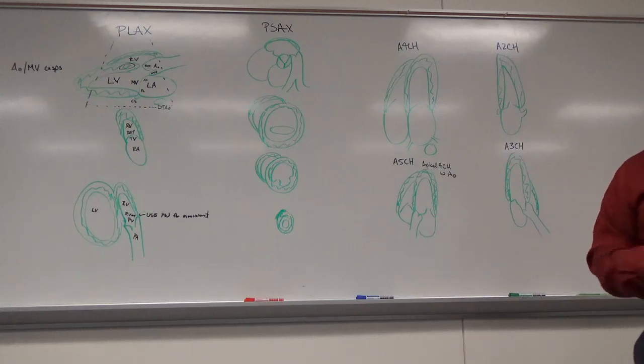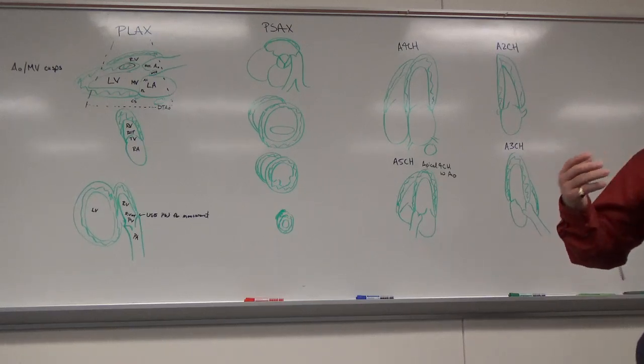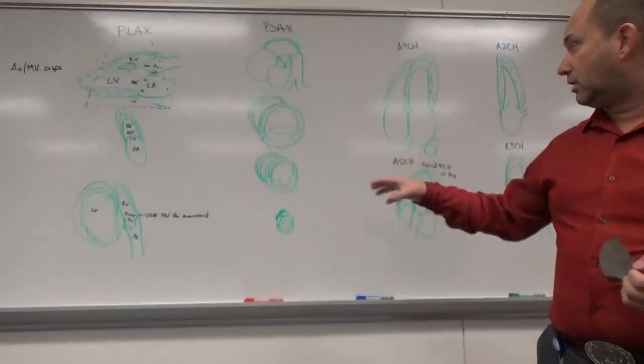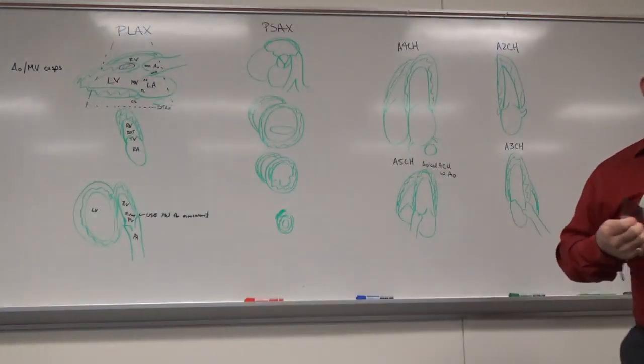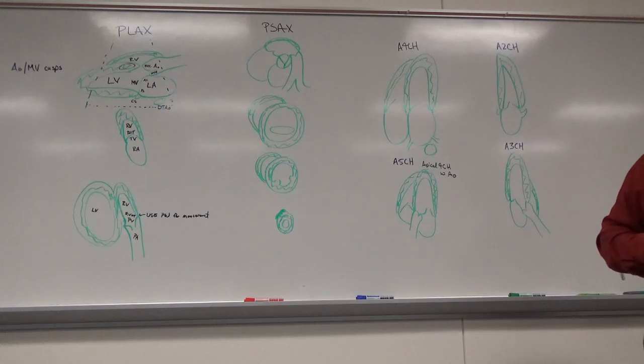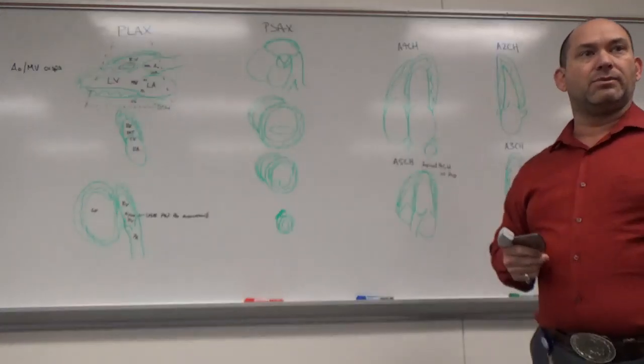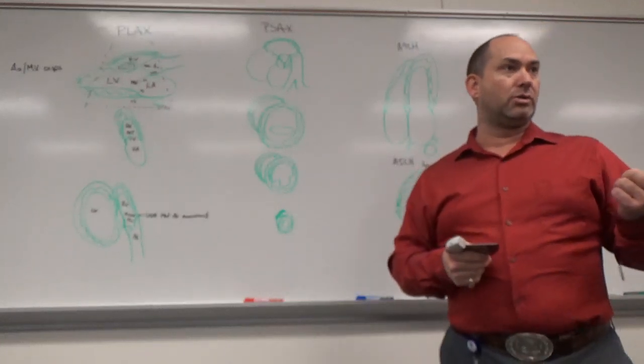And you learn how to command the patient, not in a mean way, but firmly enough to tell them what's going on. The other thing that we have to do, especially with apical views, is you have to anticipate where their heart's going to be, because when I tell a patient to hold their breath, are they going to hold it exactly where I told them?